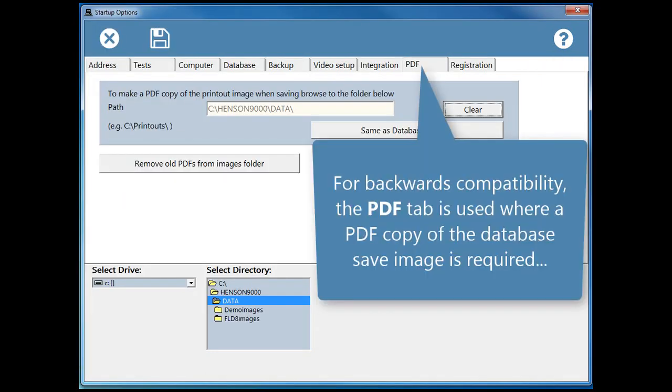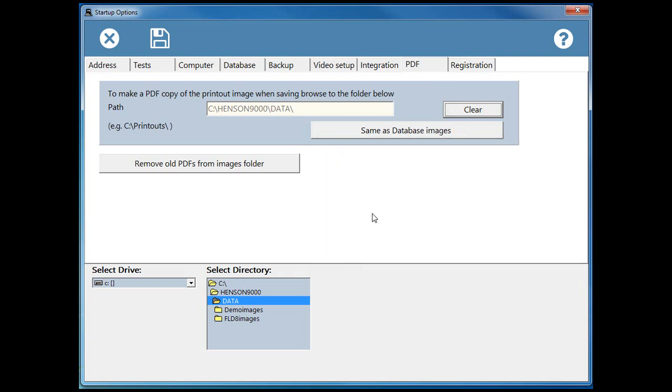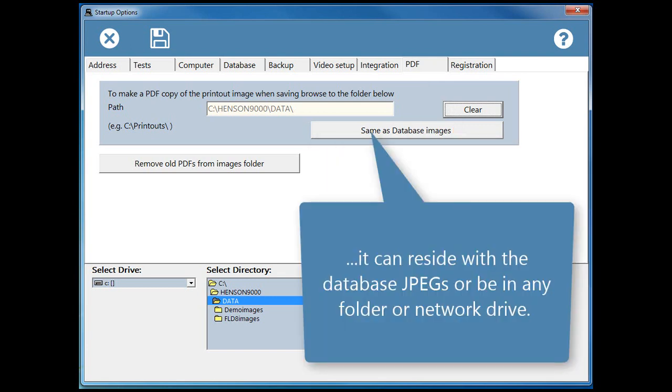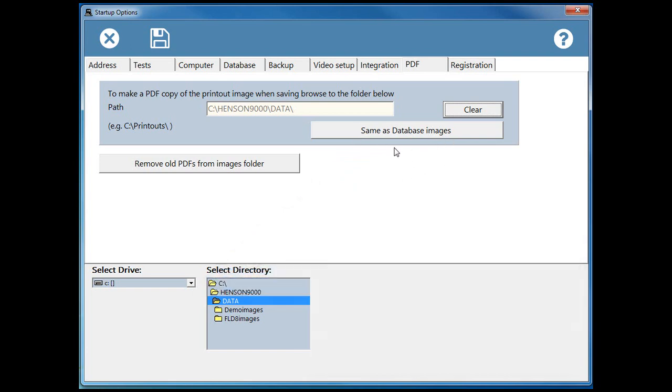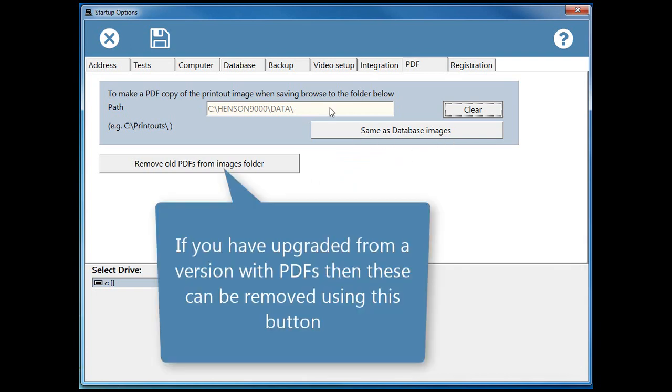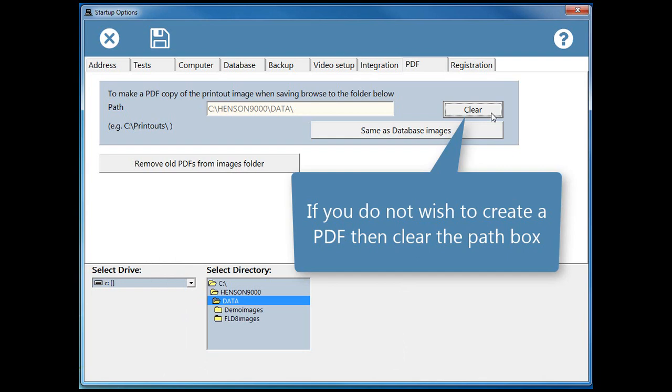For backwards compatibility, the PDF tab is used where a PDF copy of the database save image is required. It can reside with the database JPEGs or be in any folder or network drive. If you have upgraded from a version with PDFs, then these can be removed using this button. If you do not wish to create a PDF, then clear the path box.